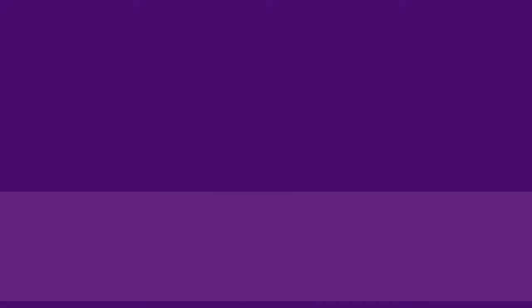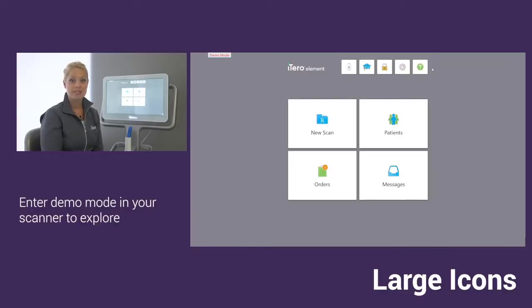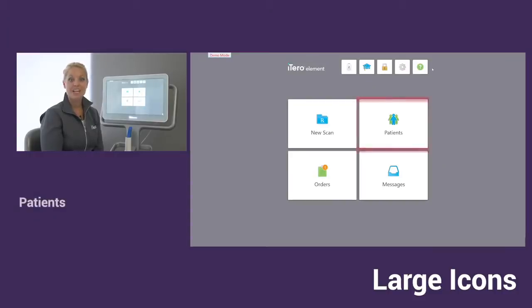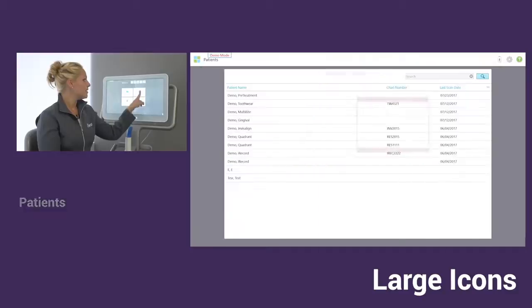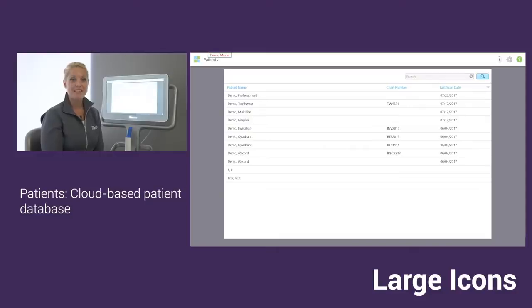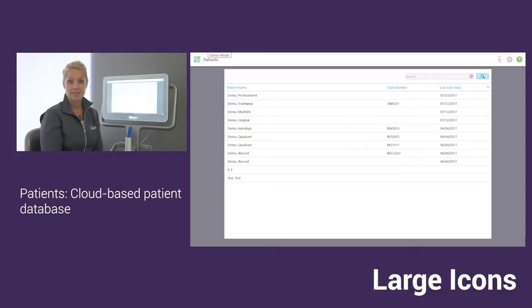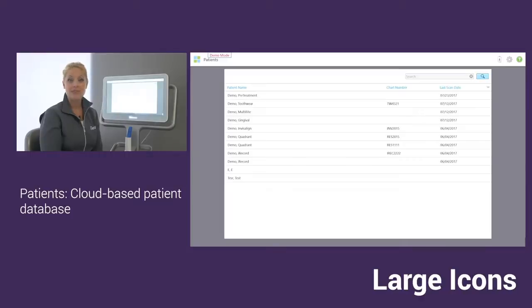Next, we're going to go into the large icons. I put the scanner into demo mode, so if you did want to do the same thing with your scanner and follow along, it'll be easier. I'm going to start with the patient's icon first. This icon is probably one of the icons you're going to use the most. This patient's icon is basically a cloud that's going to hold all of your scans. Every patient that you scan, they're going to receive their own folder. Within that folder, you can locate and view all the scans you've done for them here in this one location.